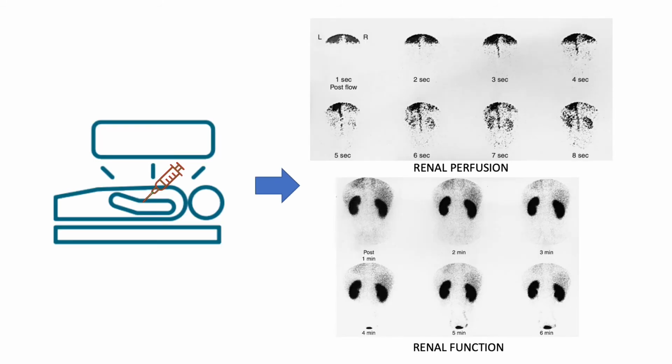Normally, both kidneys can easily be imaged on a standard or large field of view gamma camera with a parallel hole collimator. Image information is usually collected in digital dynamic mode on an interface computer and reformatted in temporal sequences that reflect both initial renal perfusion and subsequent function.